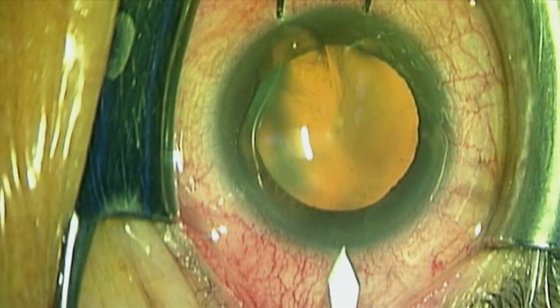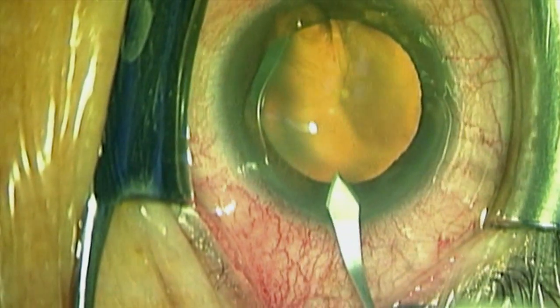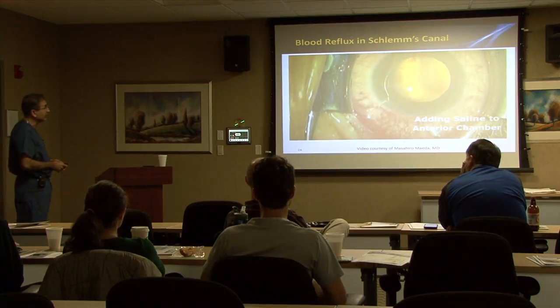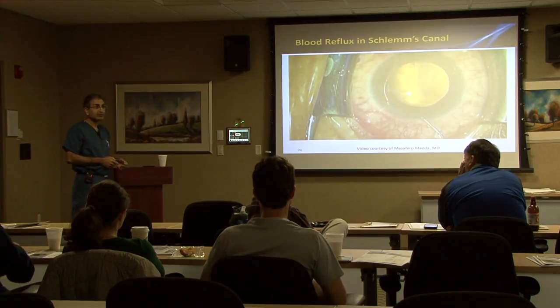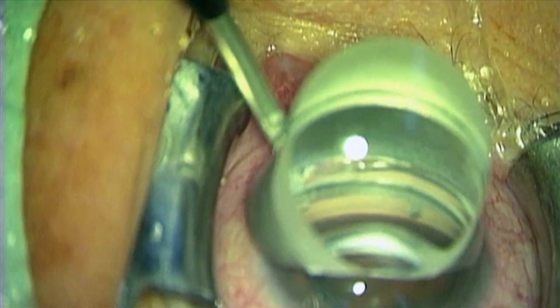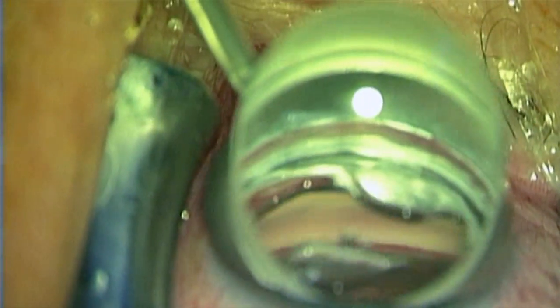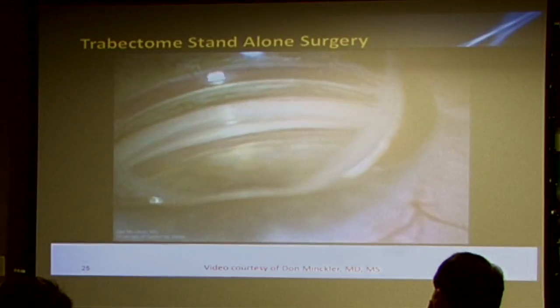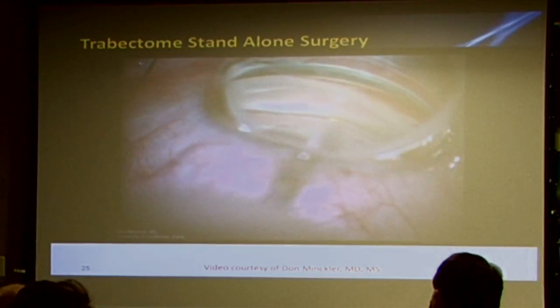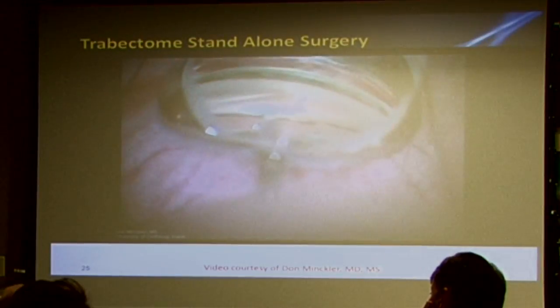What he's doing is flaring the inner lip as you can see. By flaring the inner lip of the incision, that allows you to get a wider treatment arc so you're able to ablate more of the angle. I have seen slightly lower IOP results after I started flaring the lip. But as I said, when you first start doing it, don't flare the lip. As you saw, he decompressed the eye to allow blood to reflux in, and then it's like a nice landing strip with lights that makes it really easy to know exactly where you are.